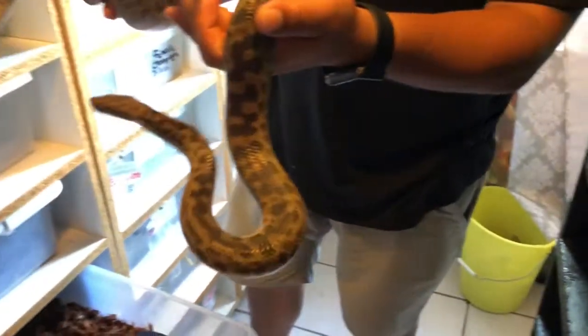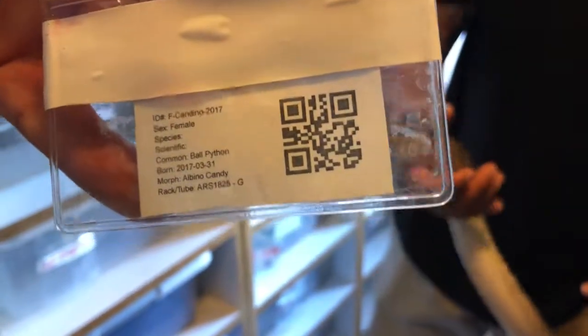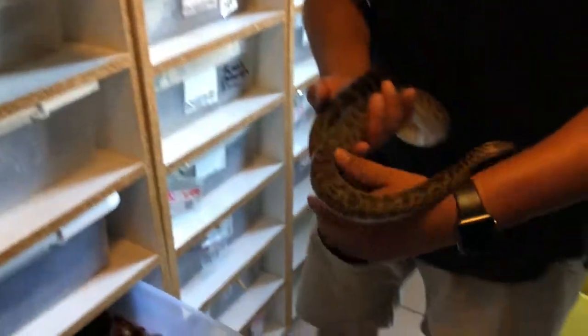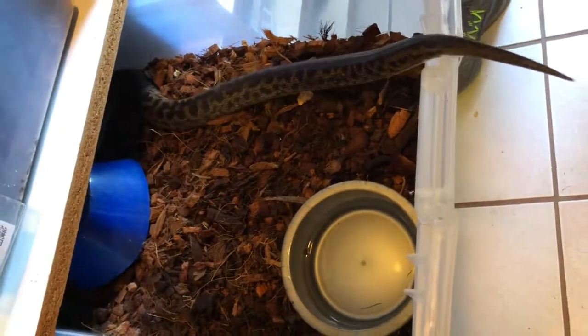We link it to the Reptis system with these awesome QR codes — Reptis scan. We link all that together and that's pretty much it. We'll check her back in a week and then in two weeks to make sure she doesn't have any infection. The microchips are anywhere from five to eight bucks apiece — well worth it when you've got quite a few that look the same.